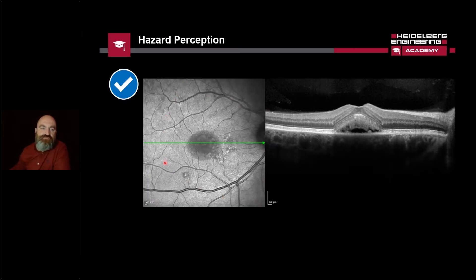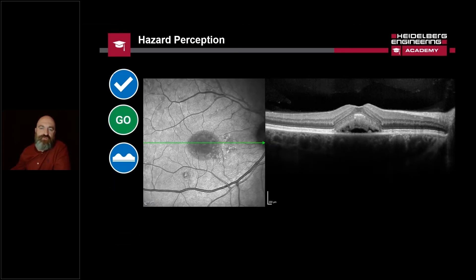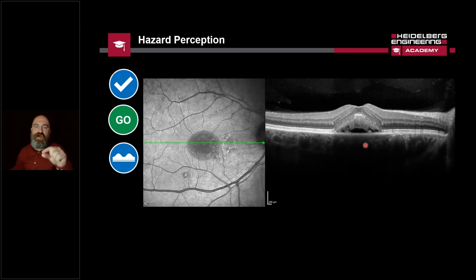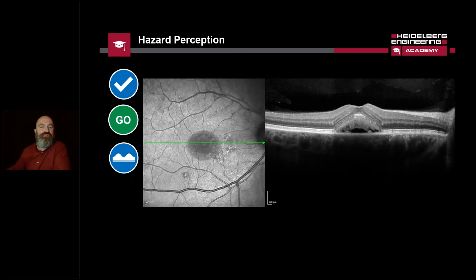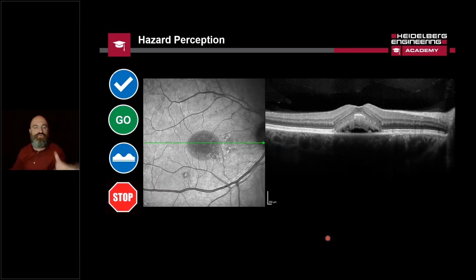The infrared fundus image is also telling us that — we have a clear view of where this B-scan is going over this circular hyporeflective blister on the surface of this retina. Let's go forwards and check the foveal profile — I can see that's there, but it's just been lifted up by this pathology we can see. What I could imagine with a patient like this is that they might have noticed a hyperopic shift in their eyesight, simply because their photoreceptor layer has been elevated by this pathology.